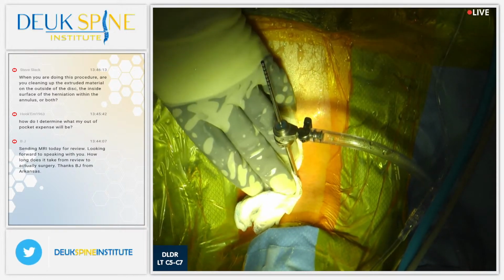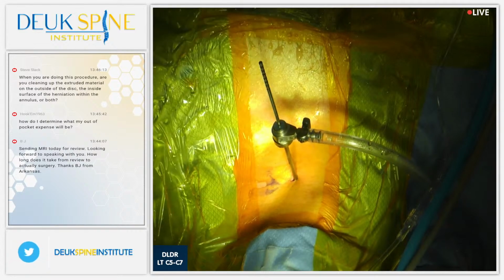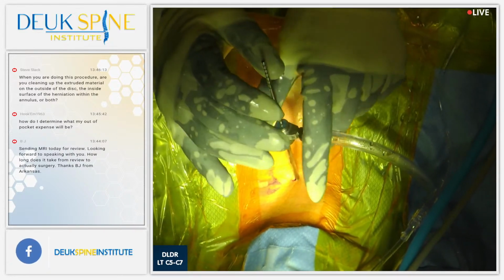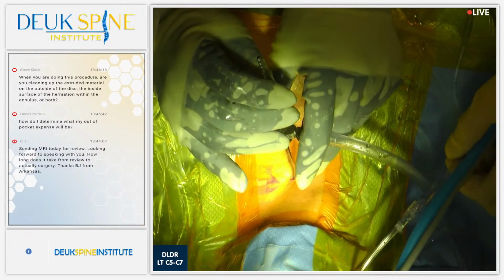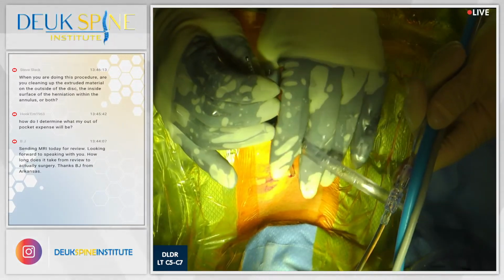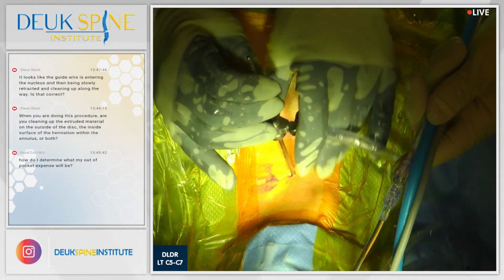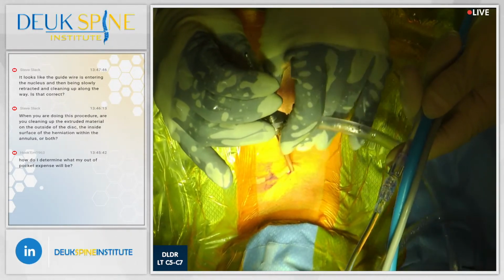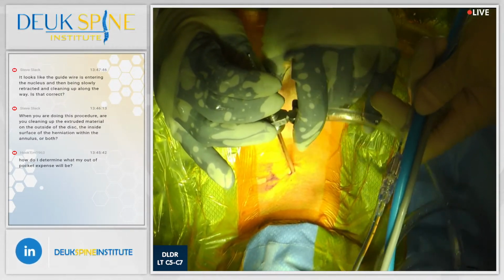Okay? The Koreans had never done this. They only treated one disc, but most people have more than one disc, so I didn't want to make them come back and have 2 surgeries. I decided to just develop a technique that works to slide to the next one. So I always start at the bottom disc. Shot. Use the x-ray. You can see the tube is coming out of the disc. Shot. All right, the dilator stays there.